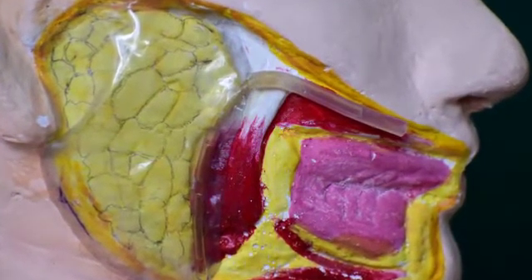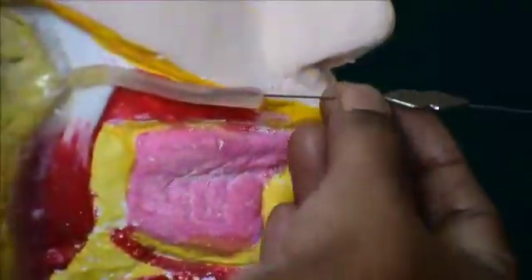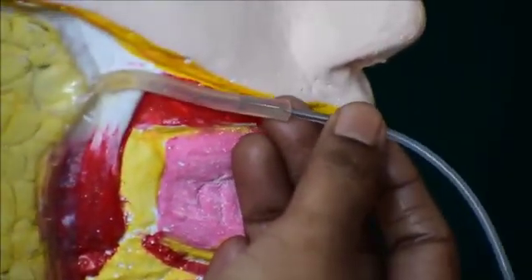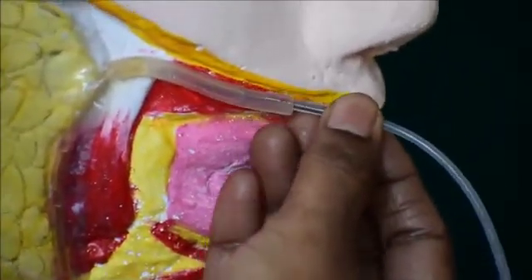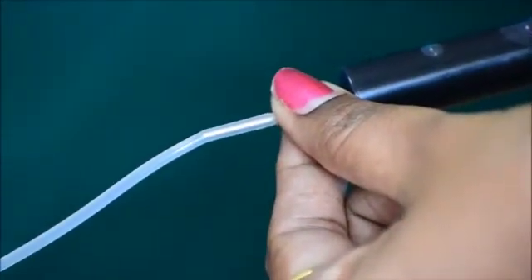After the appropriate orifice has been identified, the duct can be explored with the lacrimal probe. When the duct orifice has been adequately sized and enlarged, the sialographic cannula is inserted into the duct. The contrast media is loaded into the syringe and slowly inserted through the cannula into the parotid duct.